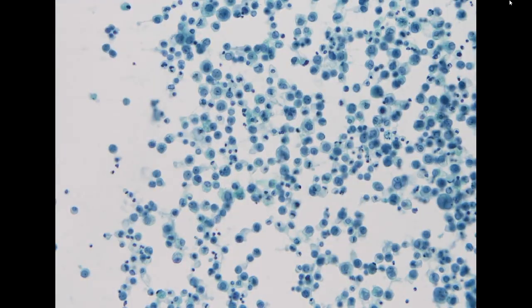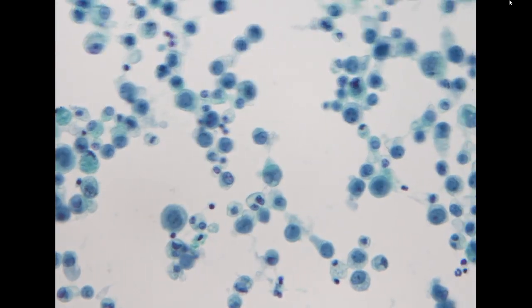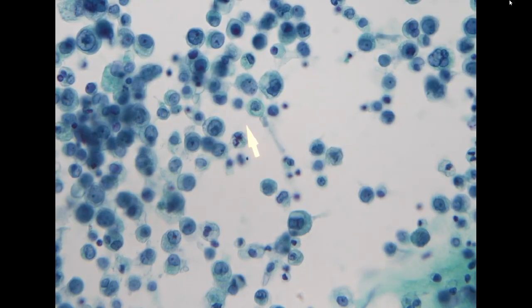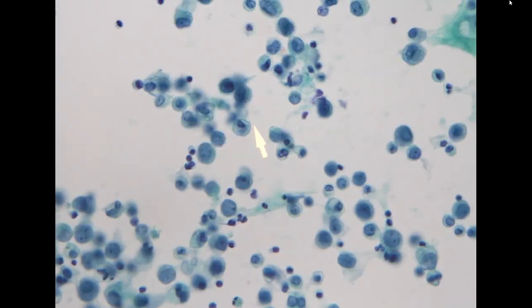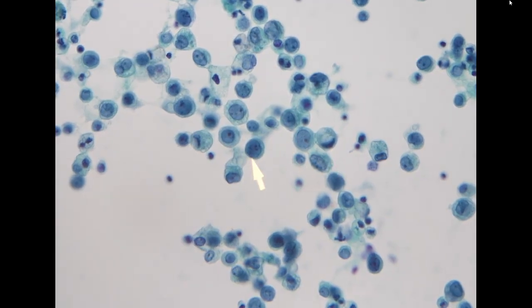So here we also see these poorly differentiated single cells, some with eccentric nucleus. Some look a little bit like signet ring cells because the nucleus has been pushed to one side of the cytoplasm. The patient is not a gastric cancer patient. He actually had a history of pancreas adenocarcinoma. So in pancreas adenocarcinoma, rarely it can present as a poorly differentiated carcinoma with single cells. So this can be compatible with pancreas cancer.